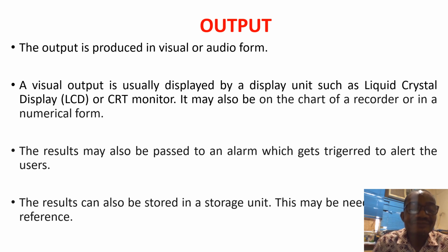Then finally, the microprocessor interprets the value that was read by the system, and the result is displayed in a display unit.